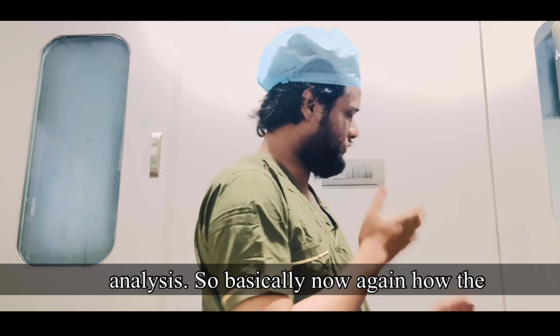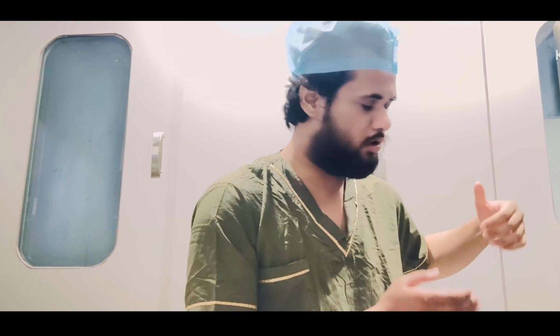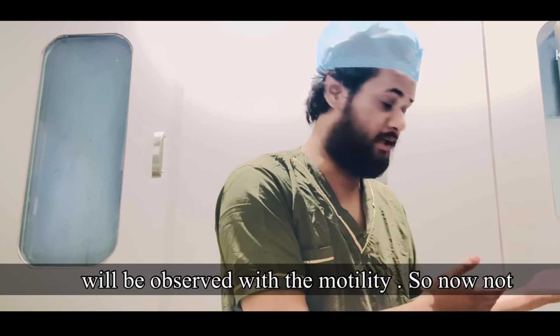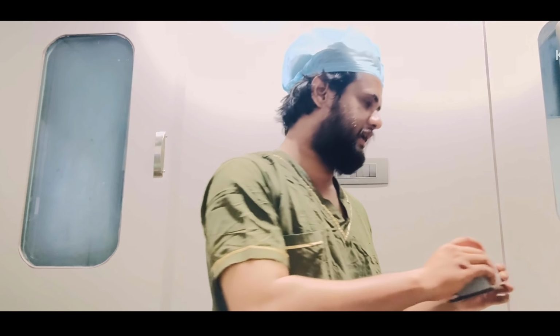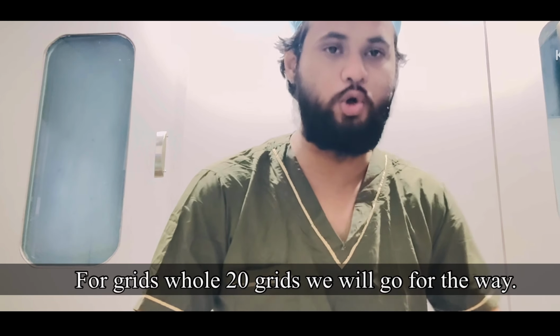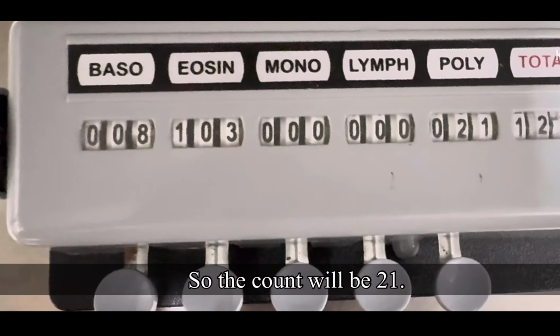So now, how will the analysis be performed? The loaded sample will be observed again, or in continuation, for motility. Not so much difference is there. We will go with the same cell counter, and after counting the whole sample, the whole 20 grids, we will go for the weight. It's 21. I will keep putting this one, so the count will be 21.